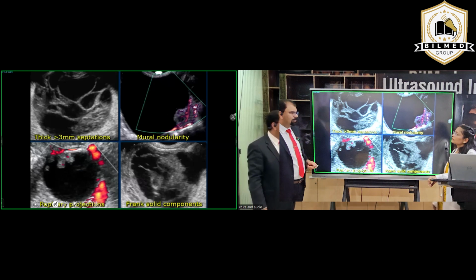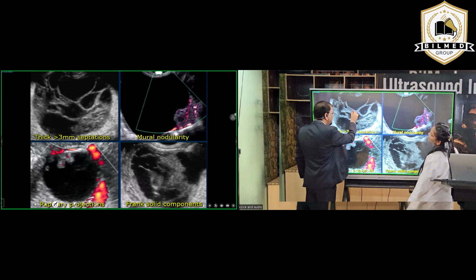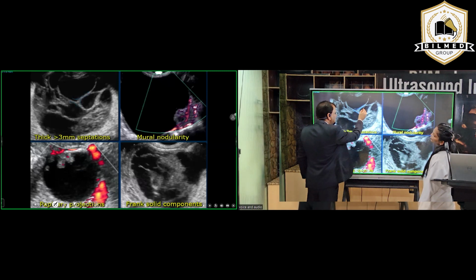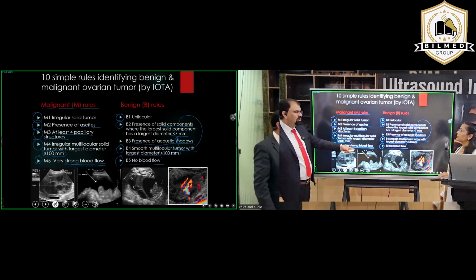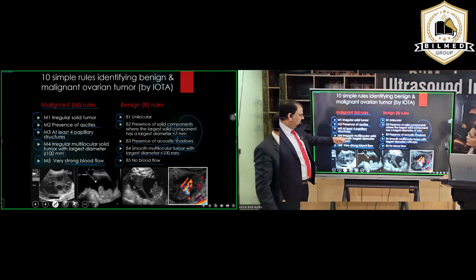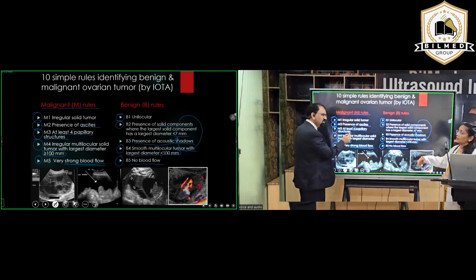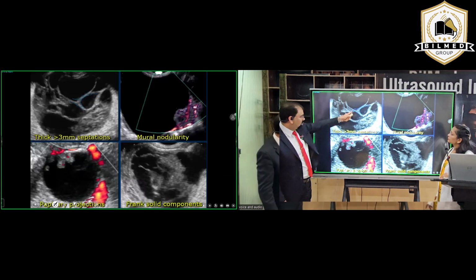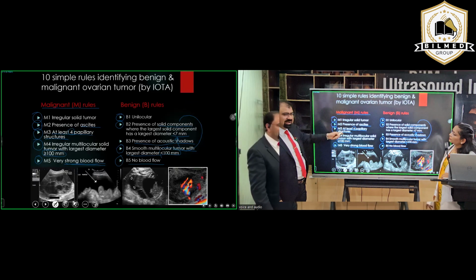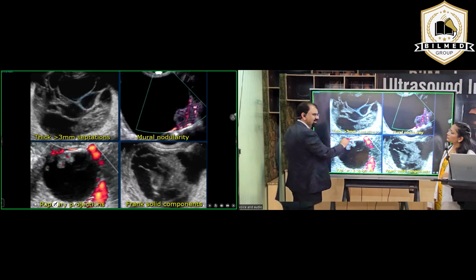Now for example, you are having a septation over here. You have to see how many septations. Multiple septations. I will not tell you each and everything repeatedly. This is actually a crisp thing. You have to see 4 papillary structures. If there are 4 papillary structures or more, then it is going in favor of malignancy. Now this is the key, and here is the lock.